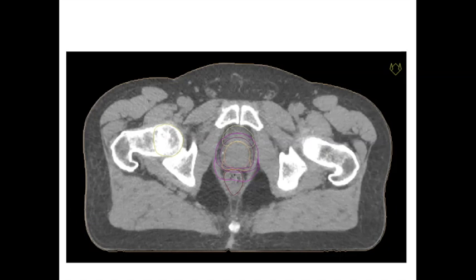And that's part of the benefits and the gains that you get from brachytherapy. Because in brachytherapy, you're sticking the radioactive source straight into the prostate. You're not having to come through the skin, through the muscle. I mean, you can see on this image how much there is to get through from the skin surface, through the fat here, through the muscle, through the bone, all the way down to the center, to the prostate. And this particular image is in the lower part of the pelvis where there's no bowel or bladder visible.